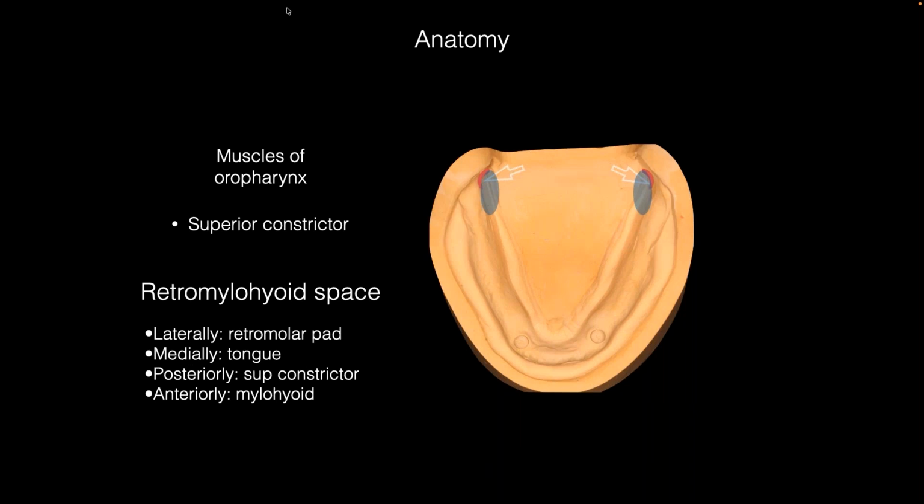And then sometimes the patient comes and says, you know, I had this denture made, and it's good, but whenever I swallow, it hurts. That's because the denture is overextended there, okay? And when that muscle is in function, it hits the denture. That muscle is usually not strong enough to knock the denture off, but it definitely creates a sore spot. And the mucosa there is actually very, very sensitive. So when you take the denture off, you can usually see a very prominent sore spot right there.